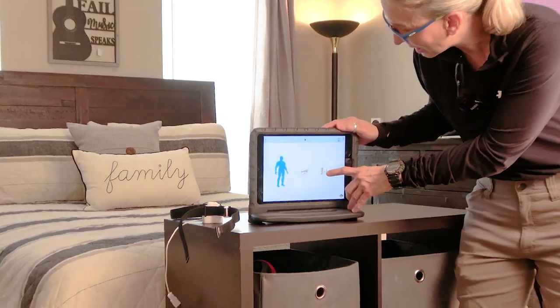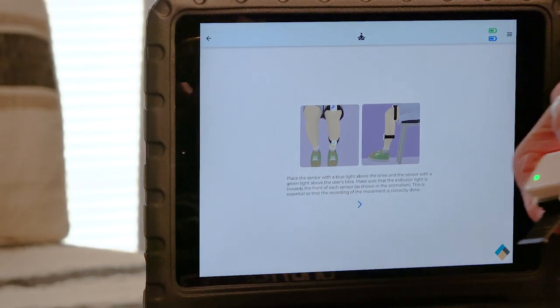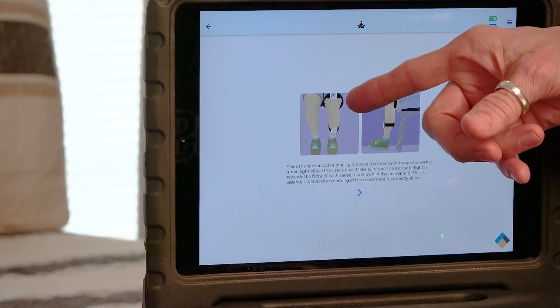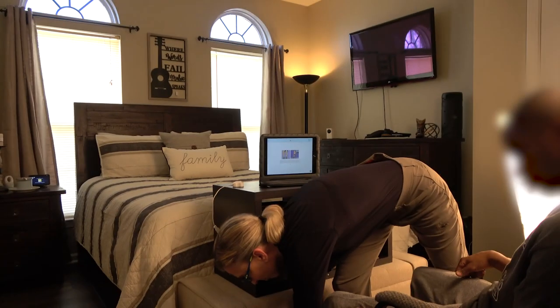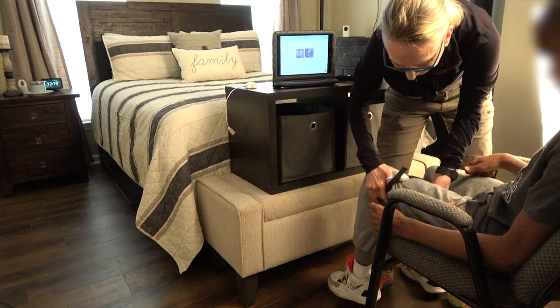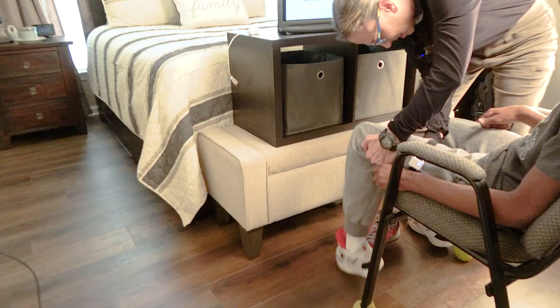I'm going to choose the sit-to-stand one. The next screen shows the placement of the sensors. There are two sensors — one with a green light and one with a blue light — and you have to put the sensors on very specifically. The blue one needs to go up on the thigh. I use two bands on my sensors because it makes it easier to accommodate different sizes from a wrist all the way up to a thigh.